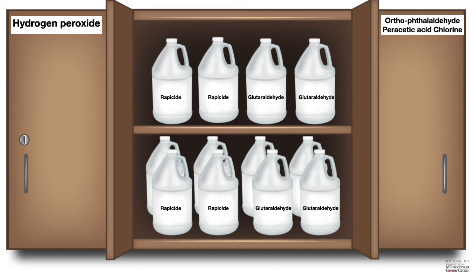A couple of concepts to keep in mind. One, before you open the container, make sure you look at the shelf life of that container. If the container shows that the shelf life has expired, then that disinfectant solution is going to be of no use. So make sure you check the shelf life before you open the bottle and use that disinfectant.